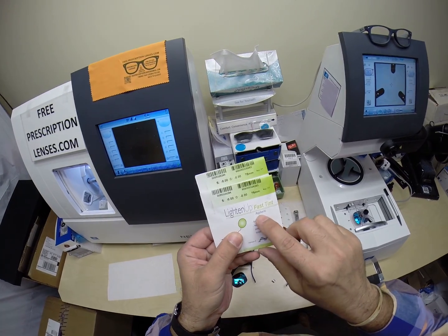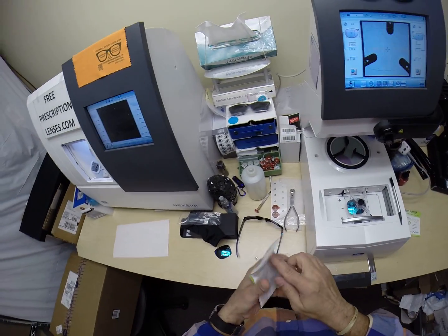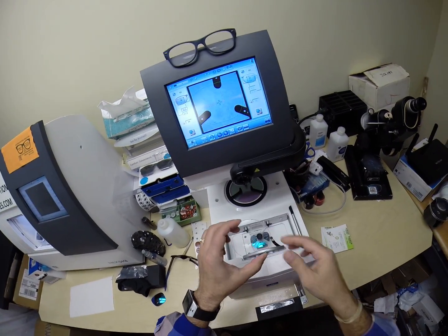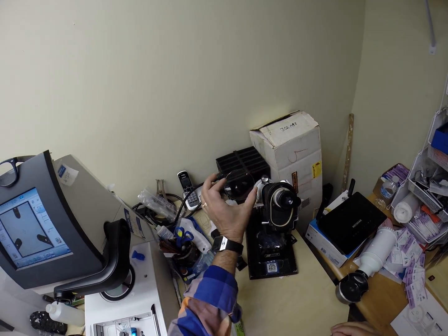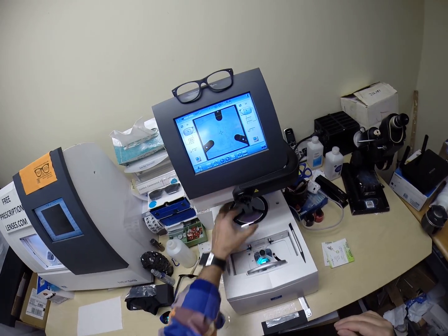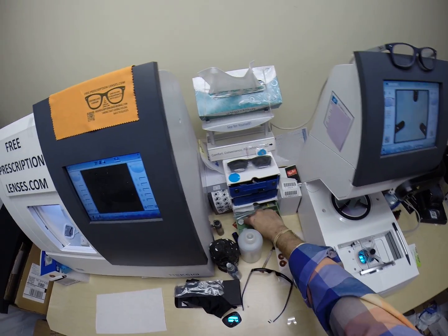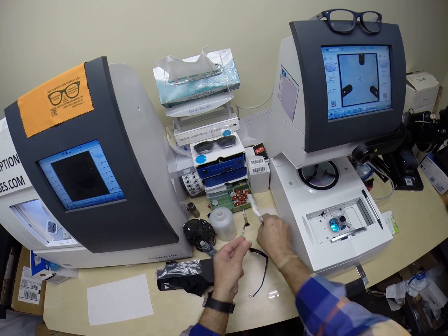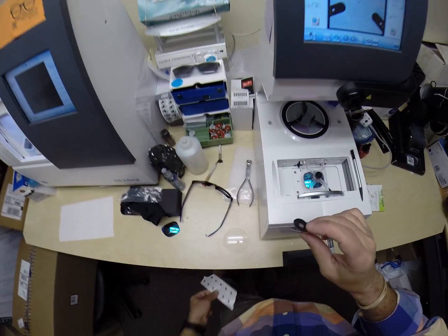These are polycarbonate lenses, aspheric, flatter curvature to fit in today's flatter curvature frames. Take the first lens again. If these were prescription, I'd put it in the lensometer, put 3 dots on there to tell me how it orients in there. But since they're not, I need 2 blocks. Or as I like to call them, Jenny from the block. I've got my last 2 here.